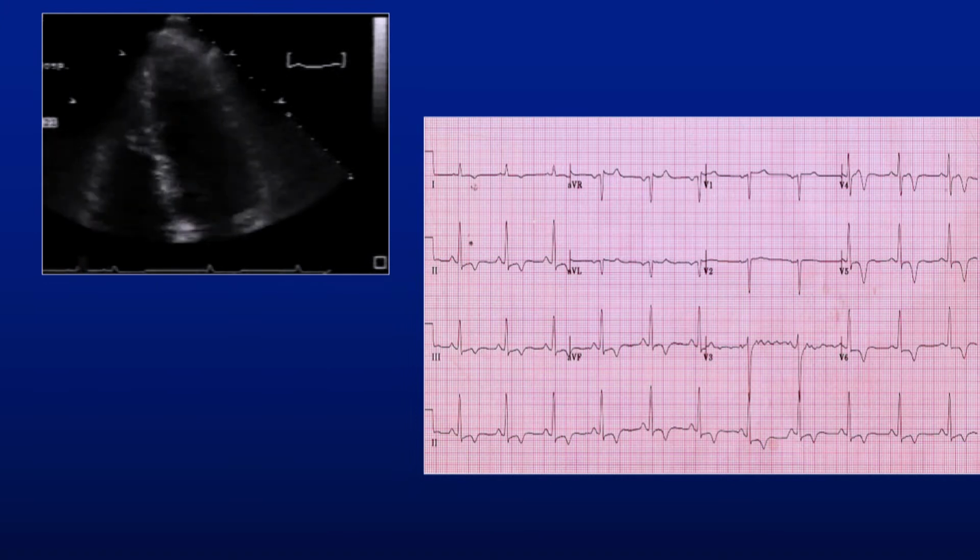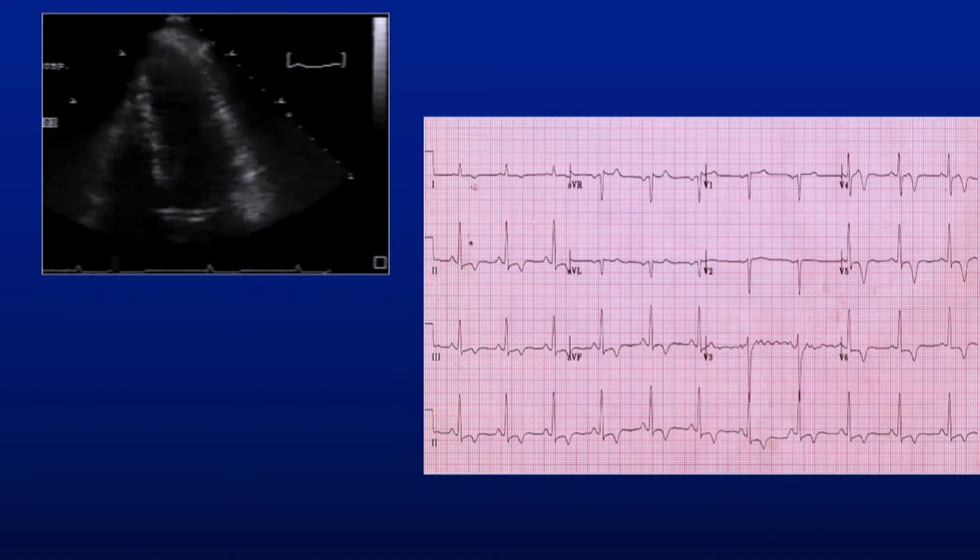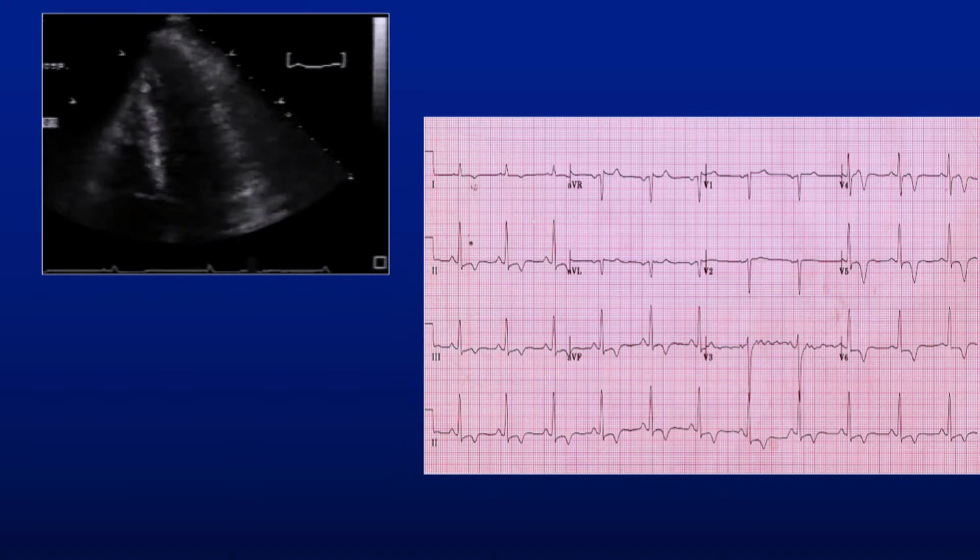So if I'm stranded on an island without contrast, I say suspicion of an apical abnormality. Can't tell, right? And the clinician would have said, thank you very much, because that's what I was suspecting from my EKG.